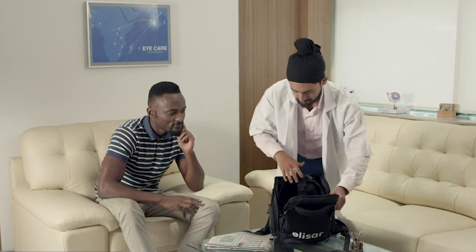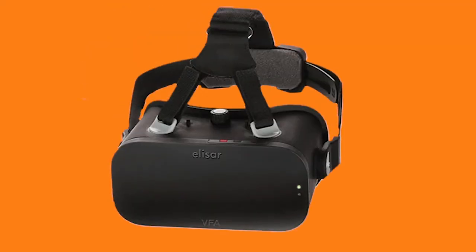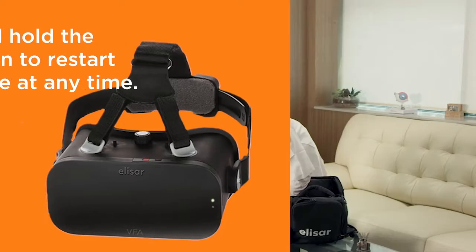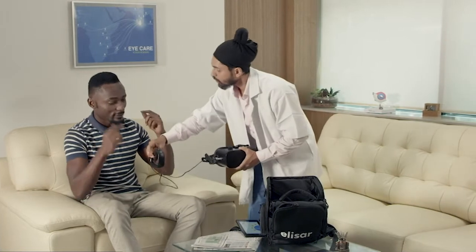Setting up AVA is quick and easy. To begin, remove the HMD from the case and turn it on by pressing the red button on the top of the HMD. Note that you can restart the device at any time by long pressing this red button. Carefully connect the patient response button to the side of the HMD via a LEMO connector.